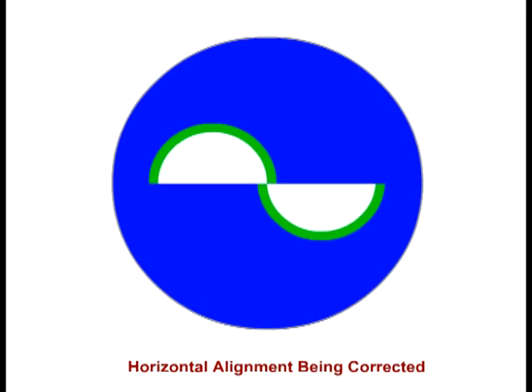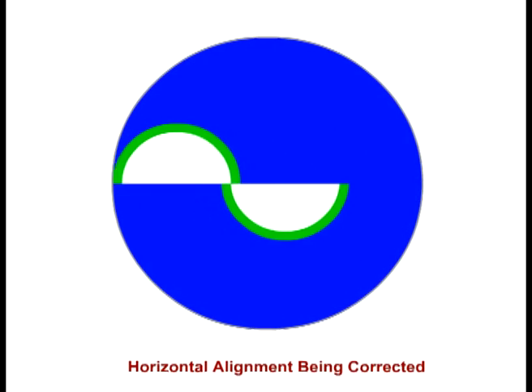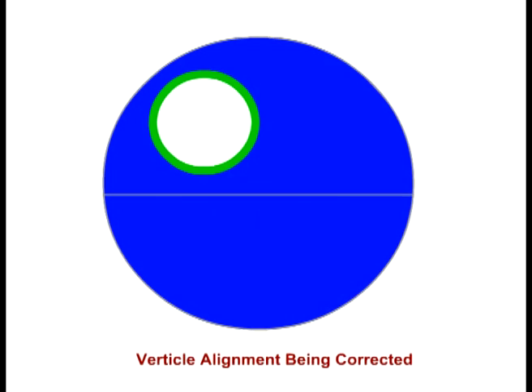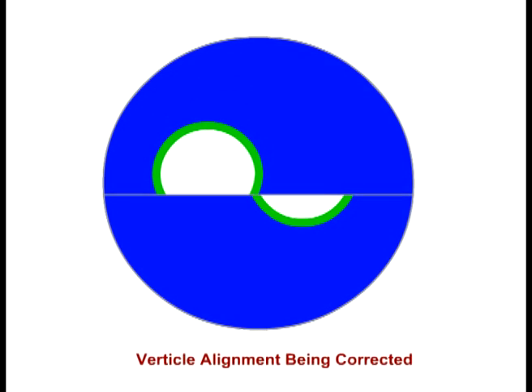This part of the video shows inaccurate horizontal centering which is being corrected. This part of the video shows inaccurate vertical centering which is being corrected. Thickness of mires should be around one-tenth of the total diameter of the flattened area. Thick mires can lead to overestimation.